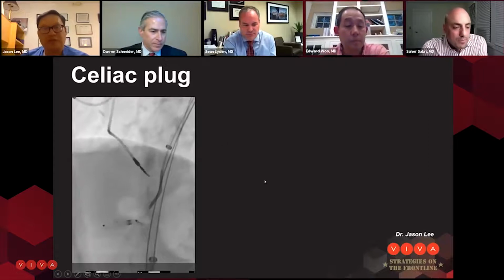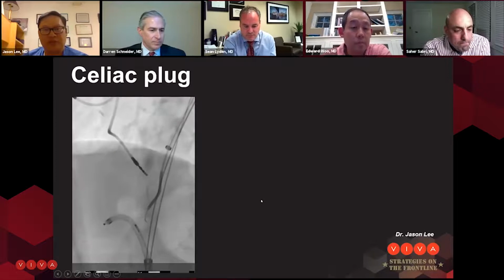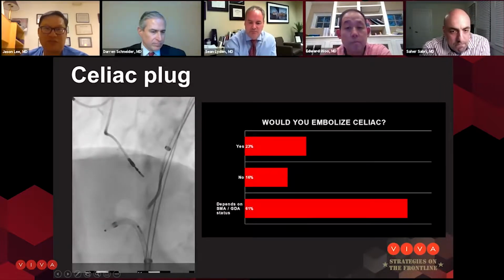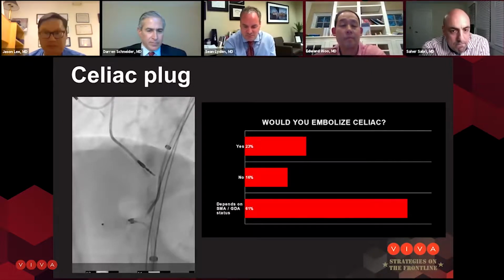Yeah, so just like Ed was saying, and to Sean's point, 3 branches of parallel graft in our hands has led to a lot of gutters. So I'm relatively liberal about covering the celiac. I guess that kind of answers this question. I'm curious what people would do, and I'll tell you that actually the GDA and the SMA were obviously wide open.